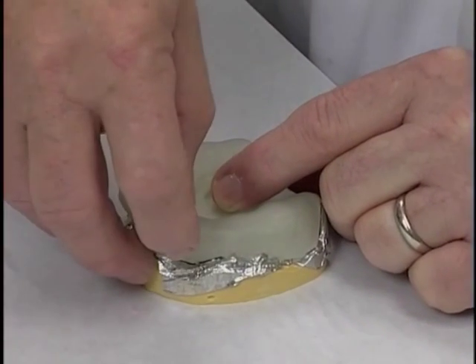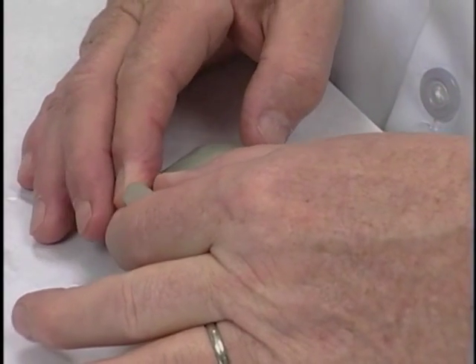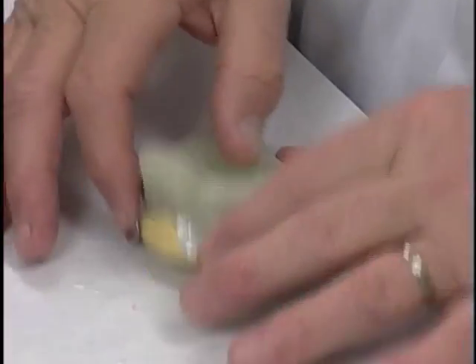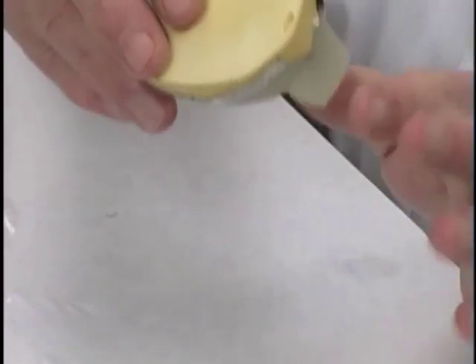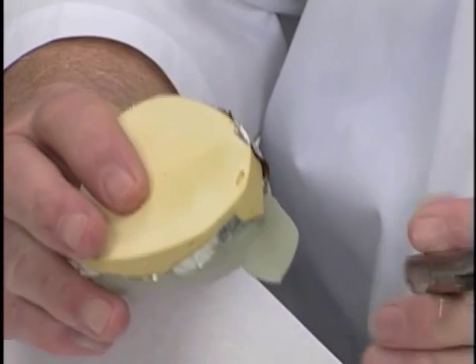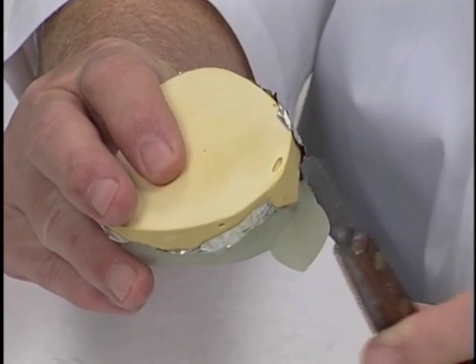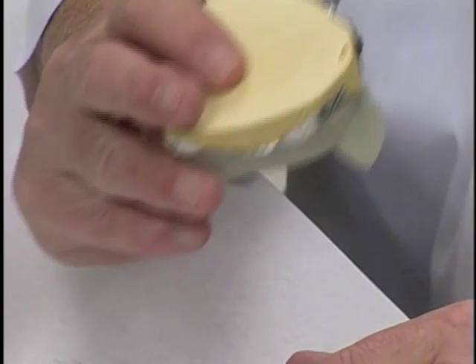and just adapted down and adapted in with the remaining material that is there, just from the original material, adapted in until it's nice and smooth, and it should be tilted anteriorly about 15 degrees from the vertical. And right now, see, this would be vertical, and it should be tilted anteriorly about 15 degrees.